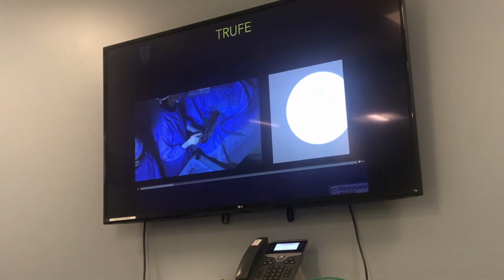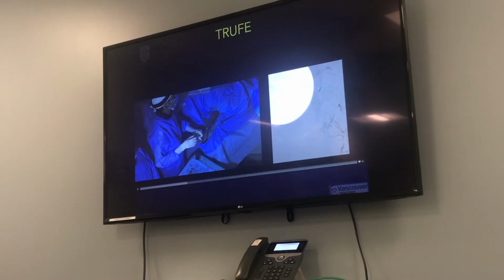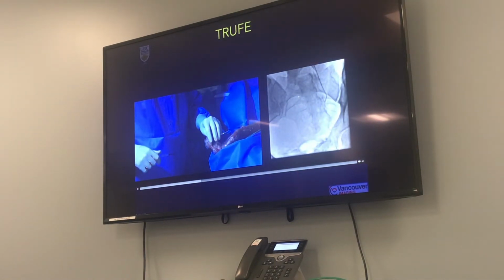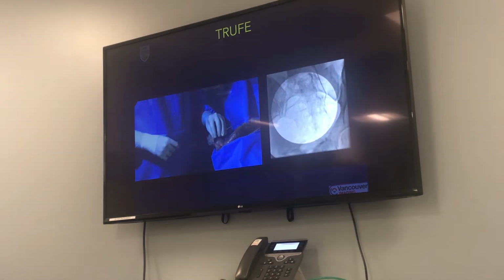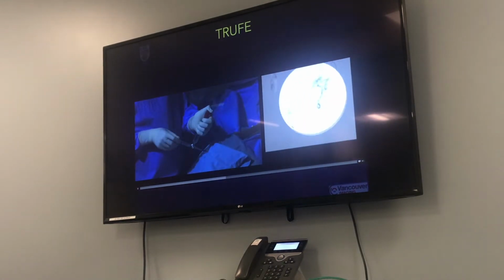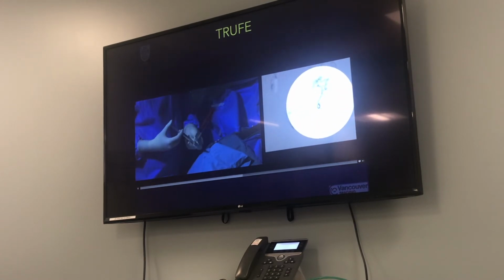And then we do lots of angiograms. So you can see this is an angiogram of the pelvis. This big squiggly vessel is the uterine artery. These squiggly vessels here are all blood vessels supplying the fibroid itself. These fibroids can have a very, very rich blood supply because they're very vascular. And then this little squiggly thing that's in there is the microcatheter. This is the microcatheter here. This all is fibroid. All these abnormal blood vessels, these are all fibroid vessels. This here is the actual main uterine artery.